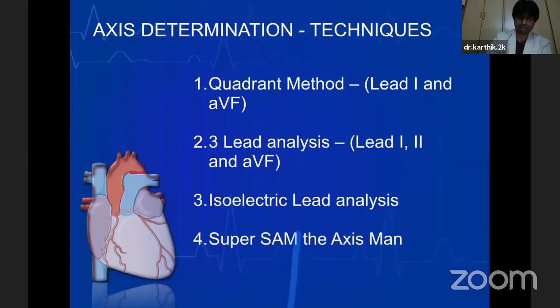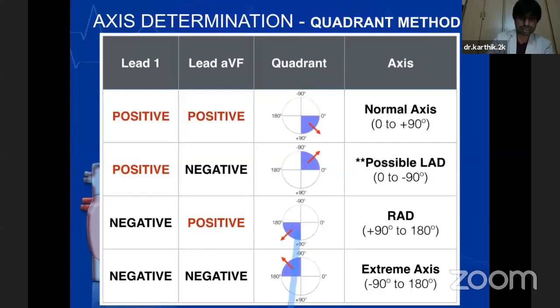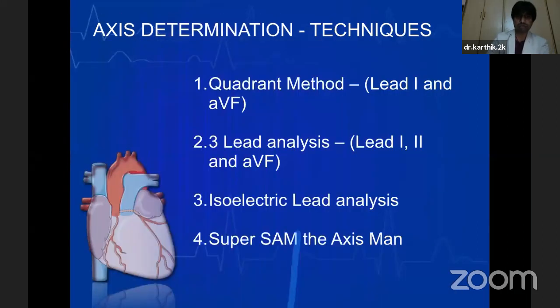We also have what is called the vector method, but that is reserved only for electrophysiologists.